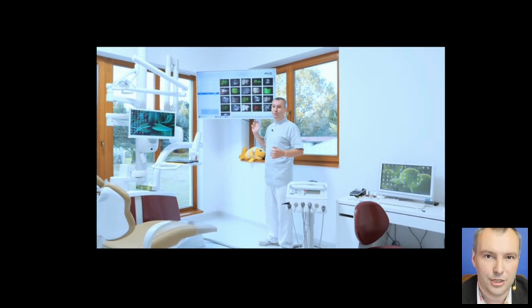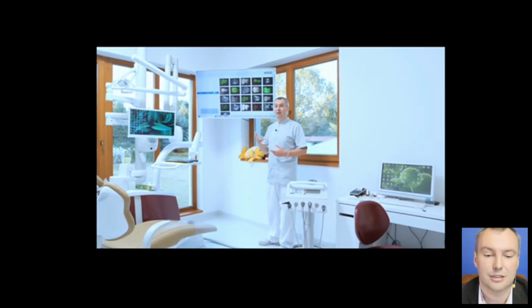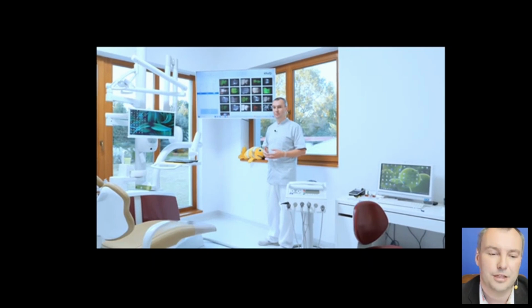This is for the patient, but also for me. So this office is built up around this. Look at your dental office. If it's at all possible, find a place for as large a screen as possible.